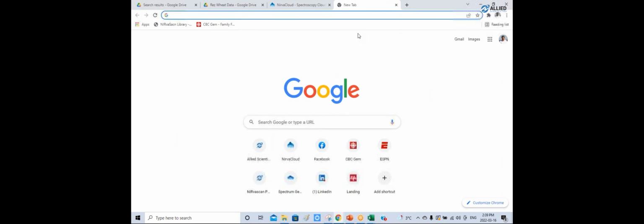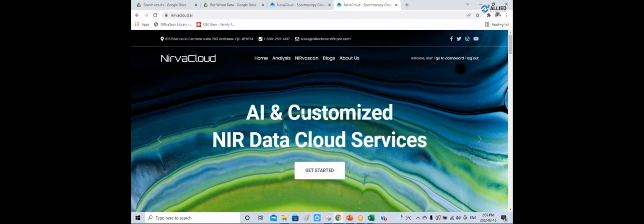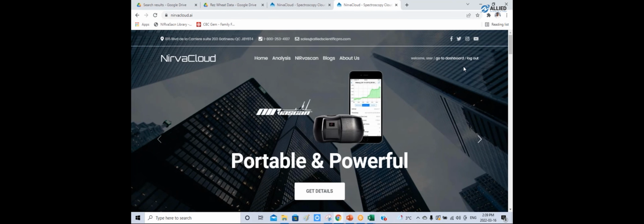Just a minute. NIRvacloud.ai. Yes, so this is the cloud platform, and I'm logged in right now, but any one of you could go there and just register. You need to register some information, including your email, your name, and then you can get started to go into the cloud. So the first thing to do would be to click on analysis.